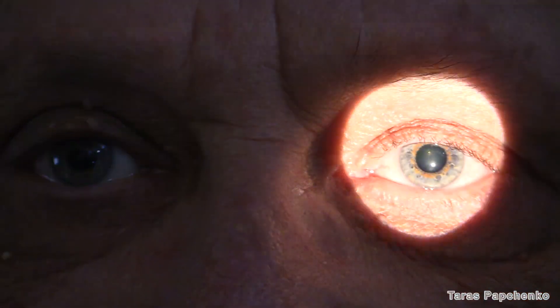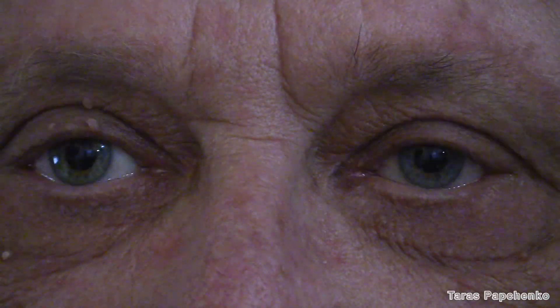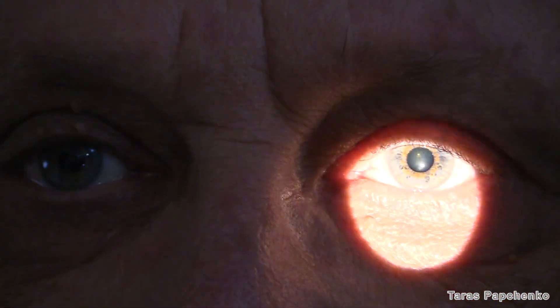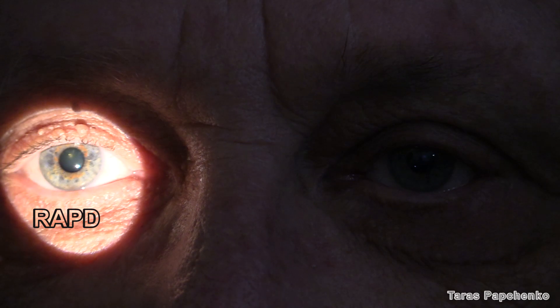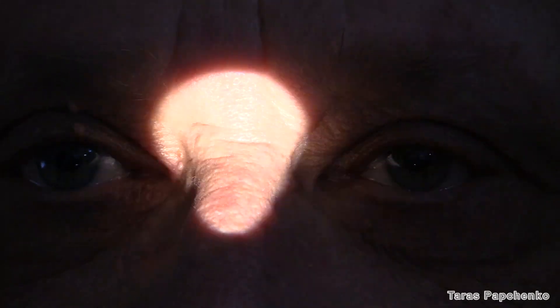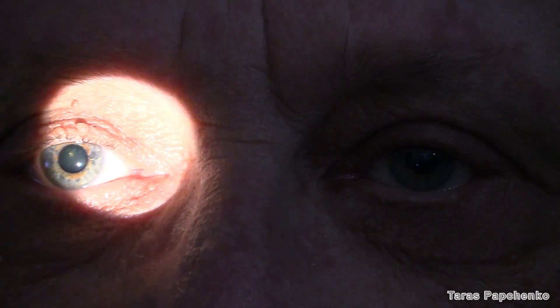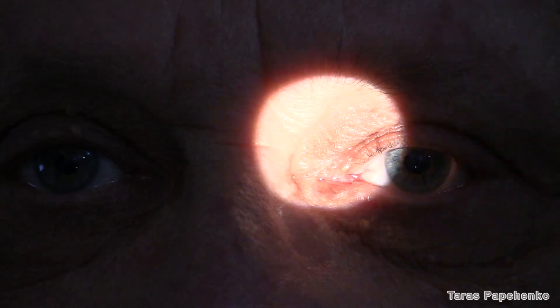In a severe RAPD, the affected pupil will constrict significantly less than a normal one, or even not at all, when tested individually. However, during the swinging flashlight test, when the light is shown into the affected pupil, the first movement will be a profound dilation.